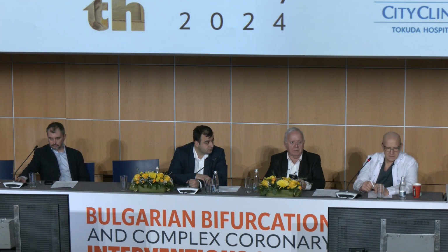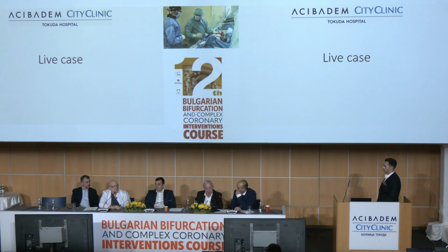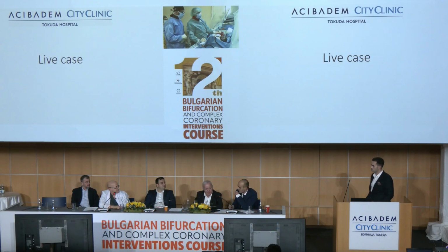What usually Yves says, we have covered the ostium and the most vulnerable part of the bifurcation. I mean, this is across, not in the carina part, but the side of the bifurcation. So I think it's quite acceptable result. And we should keep in mind that there is the contrast volume, which is not that less in this case. So we are moving to the cath lab.